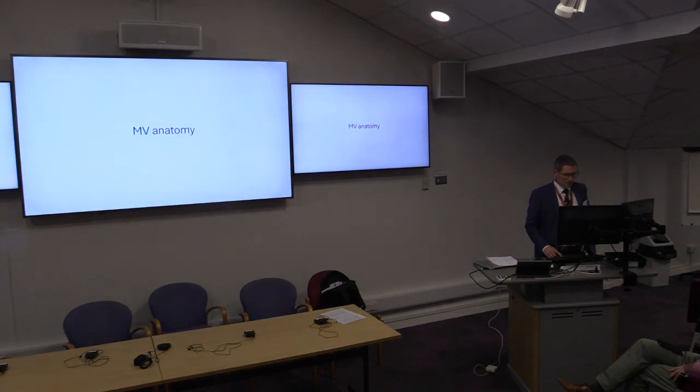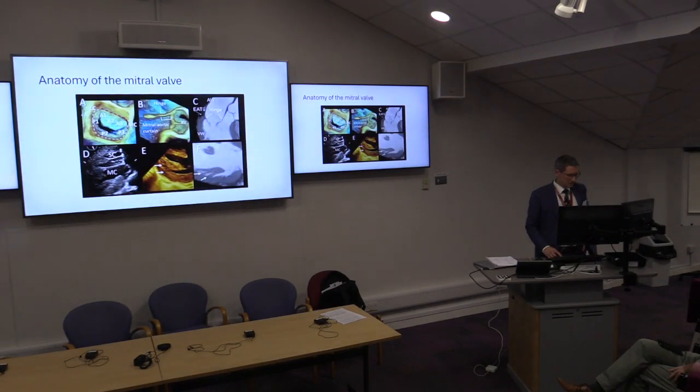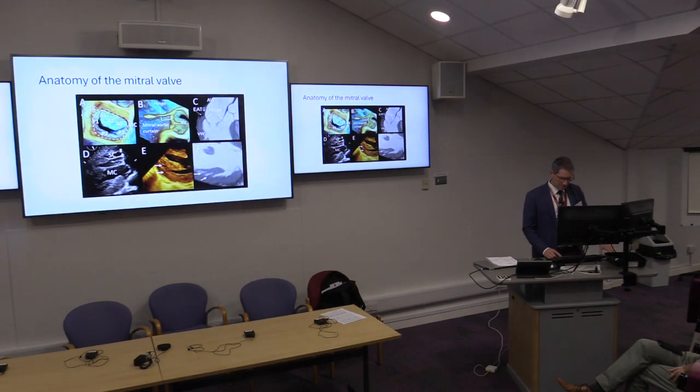So I've pinched some of this talk from that document specifically, and this slide in particular. Again, I don't want to spend too long on anatomy because you see this in theatre more than I do. I don't get to theatre as much as I'd like. Just to orientate you, this is what we're able to create now very nicely, and surgeons like this, I think, because it's not too dissimilar to what you see with your own eyes when you get in there and open up the valve. So we often talk about trying to produce this on 3D views. Obviously anterior leaflet, posterior leaflet, and you'll be familiar with the segments and scallops that are involved.